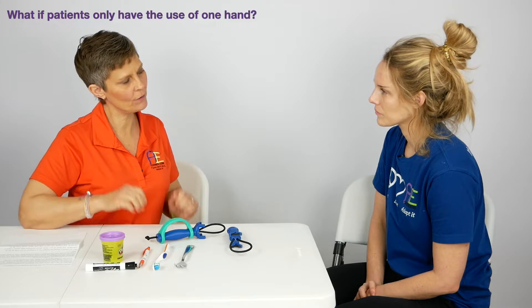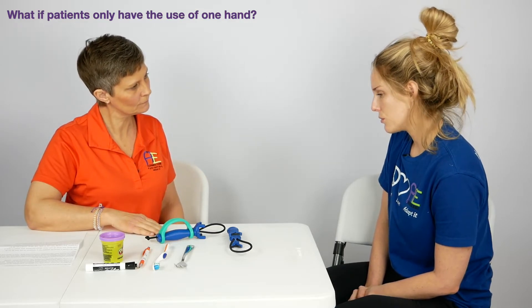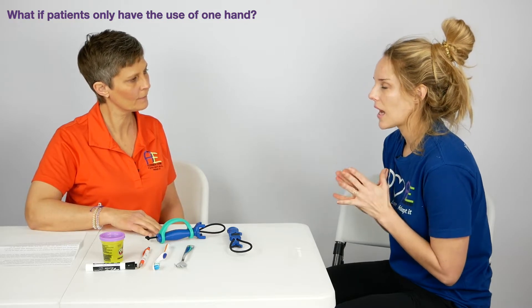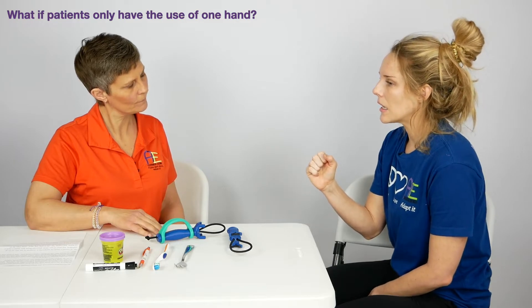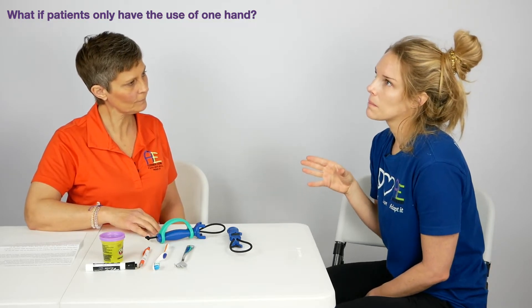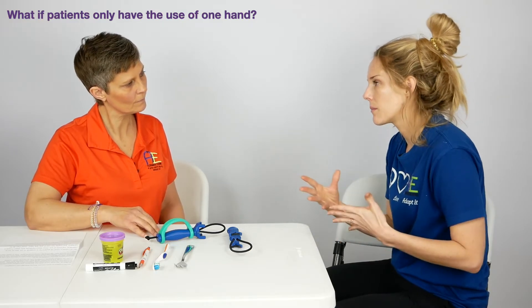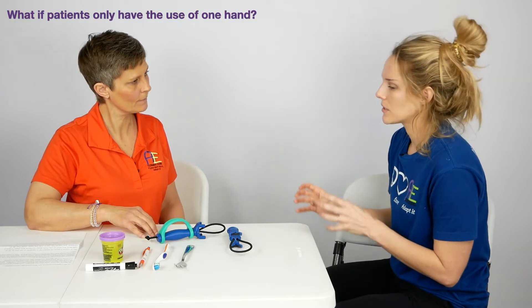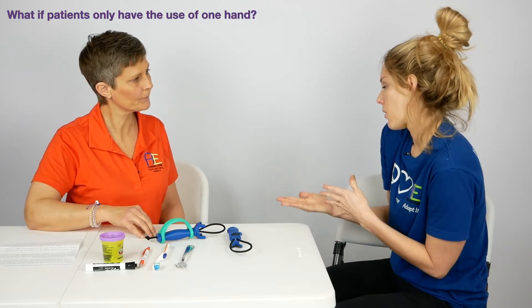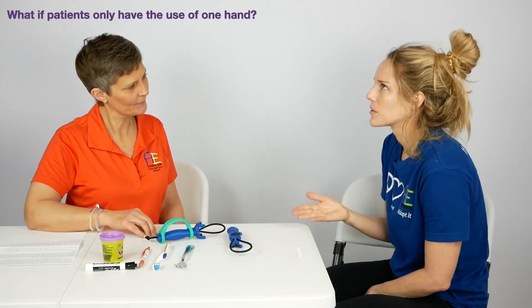What if someone only had the use of one hand — could they use the Functional Hand? I think our go-to would be to have a caregiver or family member get it all set up before the activity. With a lot of practice, if they have a little bit of grip, they could put it between their legs and manage it that way. It's probably best for someone doing a longer activity — 20 or 30 minutes — where their hand starts to get tired, losing grip or getting cramps. In that case, it's an awesome addition.